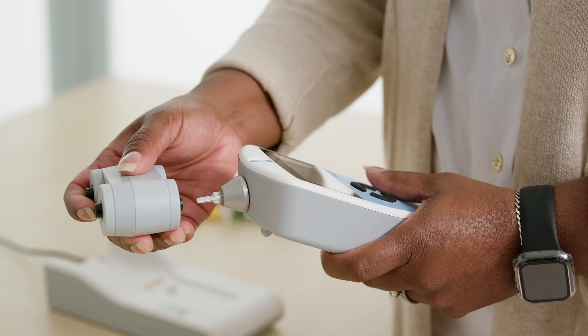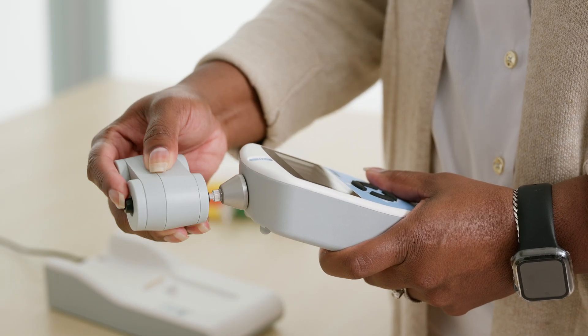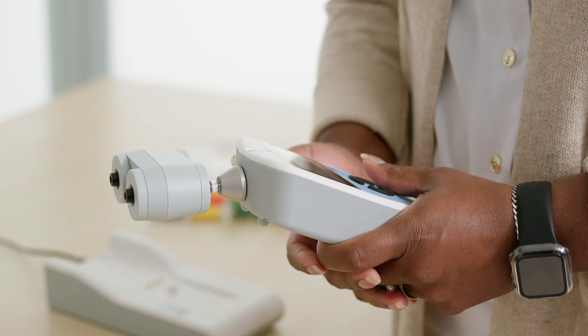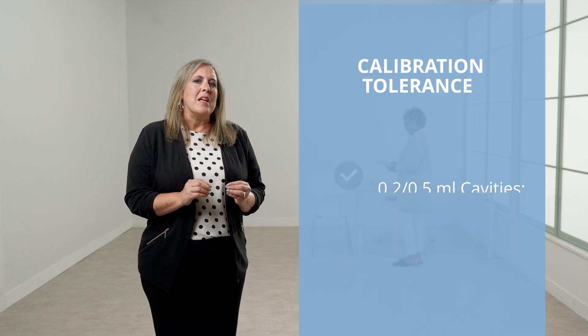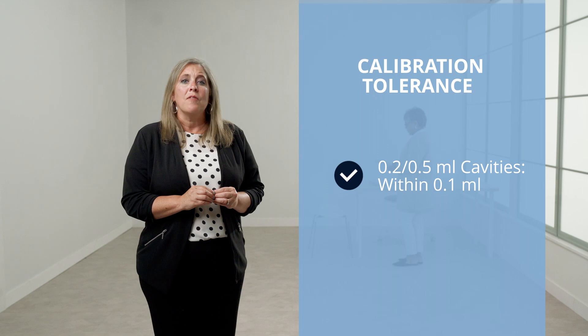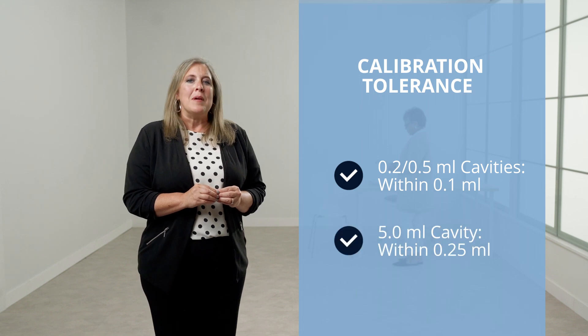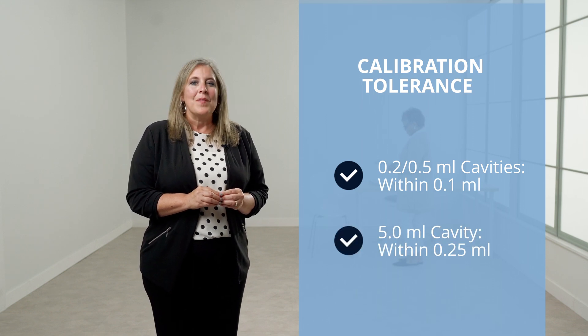When the message Insert Probe is displayed on the screen, insert the probe without an ear tip into the 2 mL test cavity. Make sure that the probe is inserted until it is flush with the cavity casing. The display should indicate the volume measured and should be at or within 0.1 mL of 2 mL. Repeat this with the other test cavities. When the checks are complete, press the left arrow to return to the main menu.